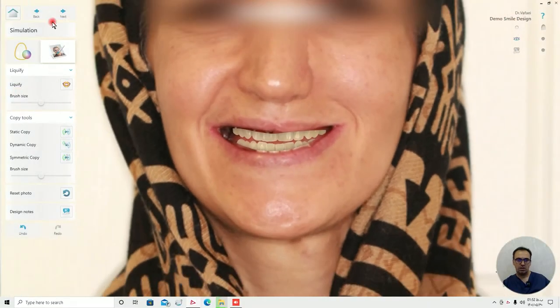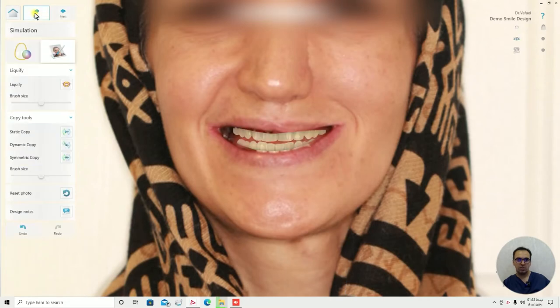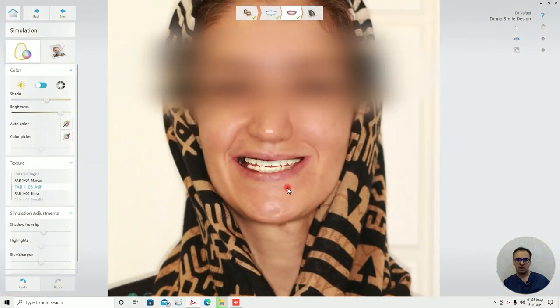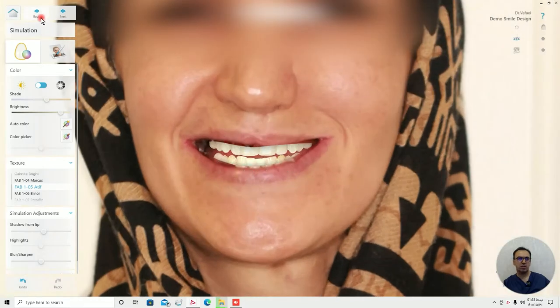I think it's a little bit better, especially in terms of this shading. I don't like this part, so I changed the teeth.